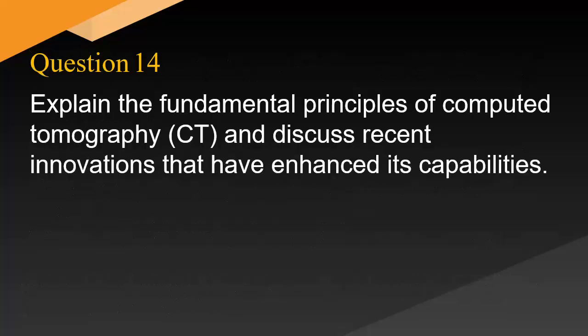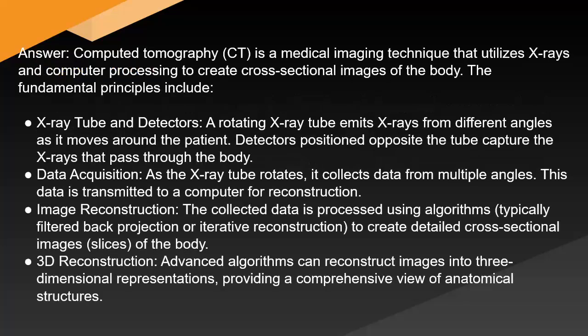Explain the fundamental principles of computed tomography (CT) and discuss recent innovations that have enhanced its capabilities. Answer: computed tomography (CT) is a medical imaging technique that utilizes X-rays and computer processing to create cross-sectional images of the body. The fundamental principles include X-ray tube and detectors.